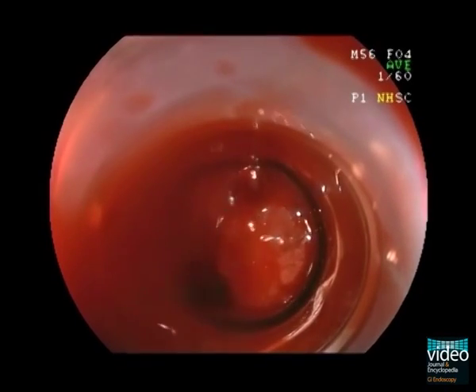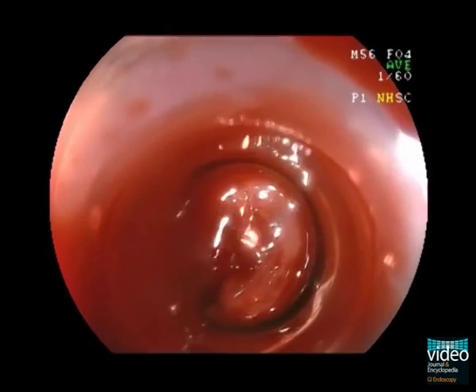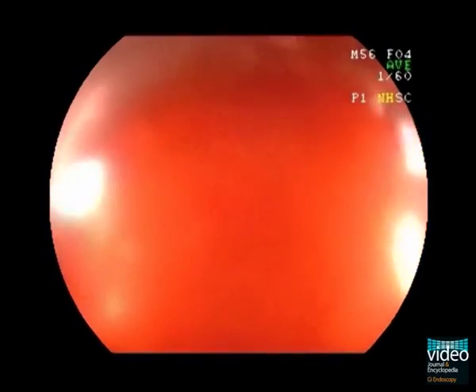After confirming the location of the target varices, keep the bleeder in the centre of the ligating device and suction to fill the cap. After the rubber band is released, flush the lumen to confirm that the bleeding has been controlled.